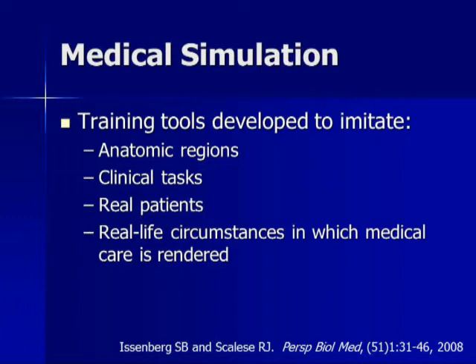I think, again, defining the clinical tasks, thankfully, the wire and angiographic techniques useful for these different areas are well suited for simulation. We can develop fairly realistic simulations because you actually don't need a live patient there. An X-ray image of a beating heart that can be made to look fairly realistic isn't very different than when I'm doing your angioplasty or your valve intervention in my own hospital.